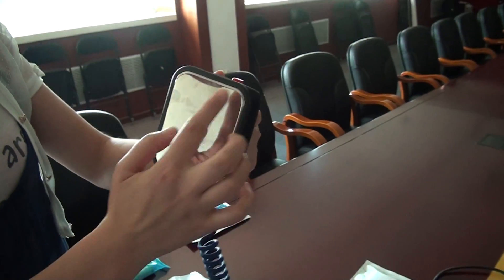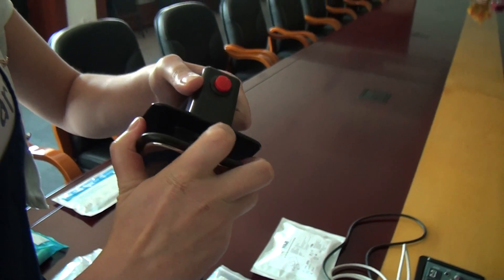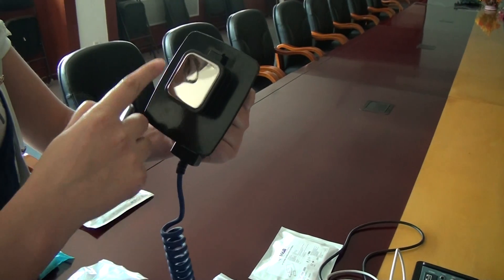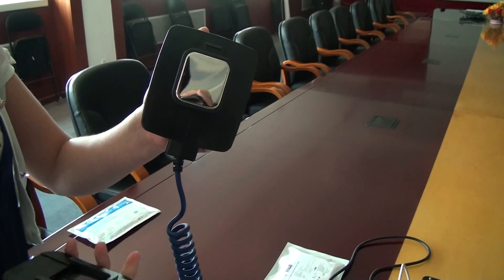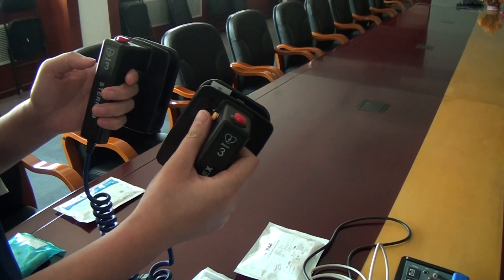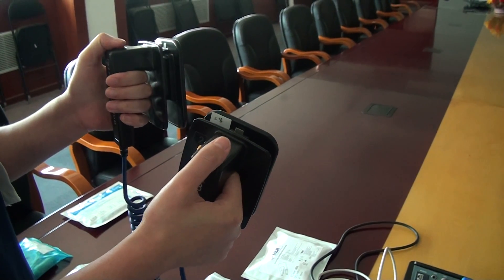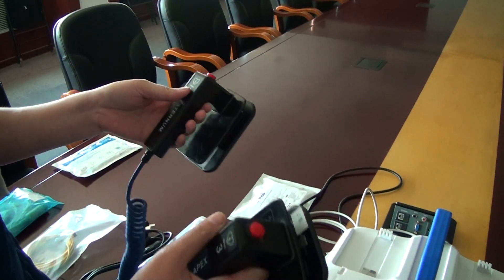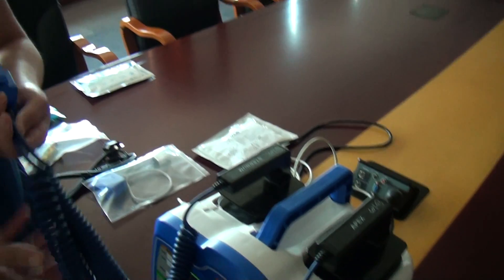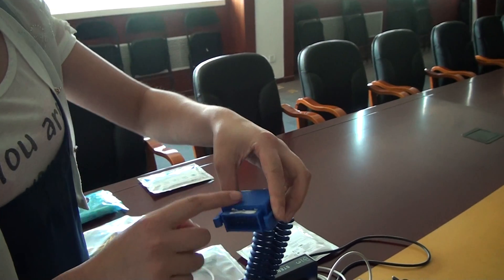Now we make an introduction for our handles. Press this button to pull up the small one, which is used for children. There are three buttons: the yellow button is for charge, and the two red buttons are used for shock. Now we connect our handles to the device.